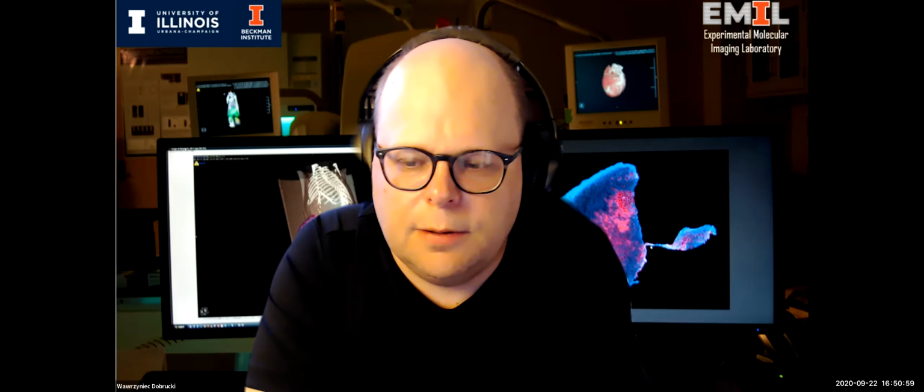We didn't change any energy because it was perfectly fine to image any objects, animals and also specimens. But one case that I mentioned today in class was the calcified specimens from the Natural History Museum. In this case, we used another scanner, which allowed us to increase the penetration energy. Okay, thanks. That makes sense.